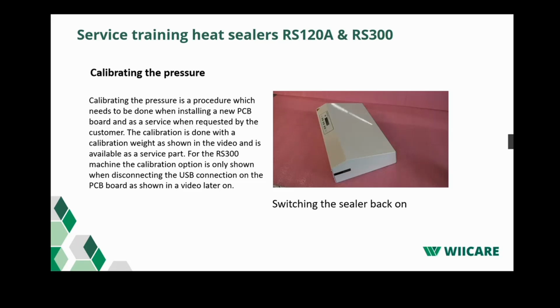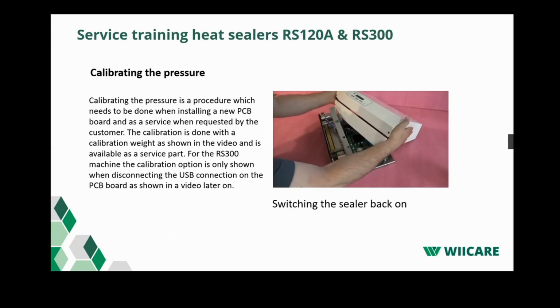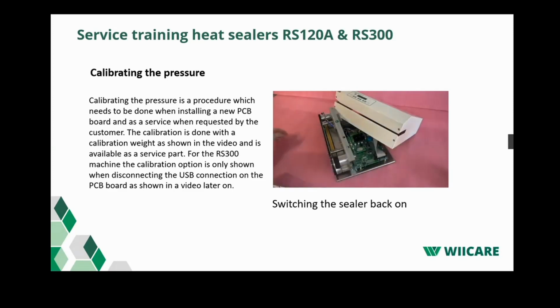In the previous video, when you take the connector for the USB off of the PCB board, you will see the extra option of calibrating the pressure in the screen. In this video, I will show you how to calibrate the force. First, remove the hood. I already removed the screws at the bottom. To be able to calibrate, a jumper must be placed on the PCB.